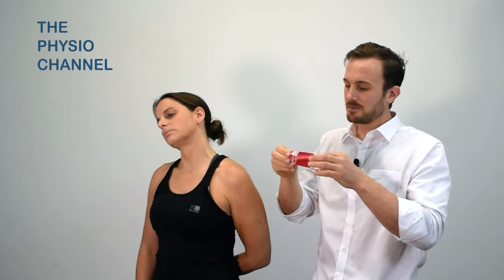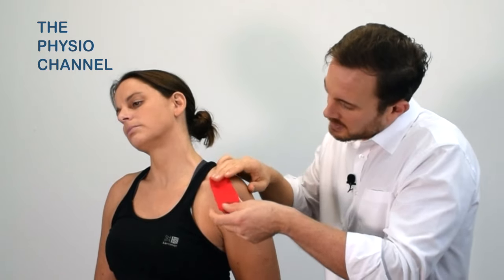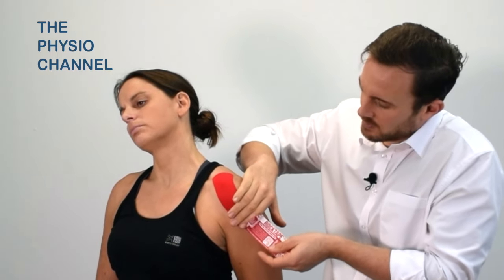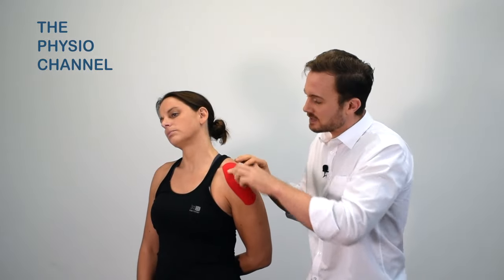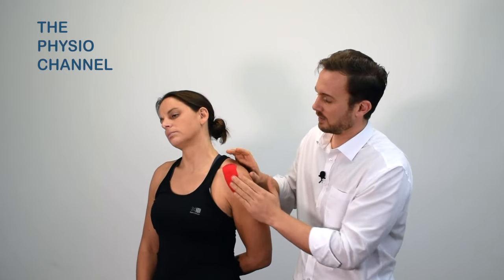Tear away the backing paper and apply the tape just over the outer clavicle with no stretch. Peel the backing paper away and by adding a little bit of stretch we can get the tape to conform and curve around the anterior glenohumeral joint. You'll also notice I've rounded the ends of the tape, which is always advisable as it helps the tape to stay in place for longer, as the edges don't catch on clothing and peel off.